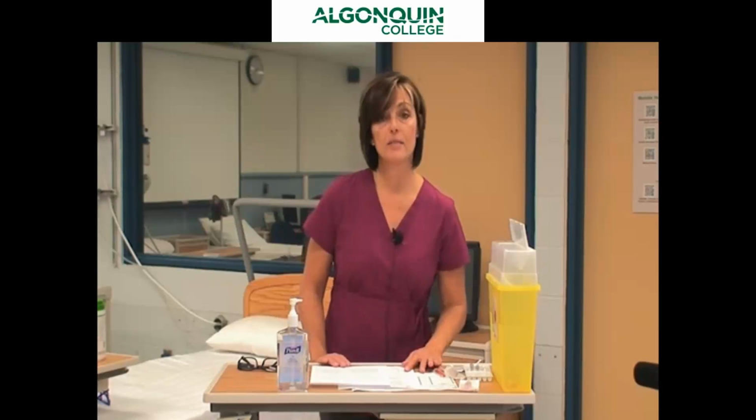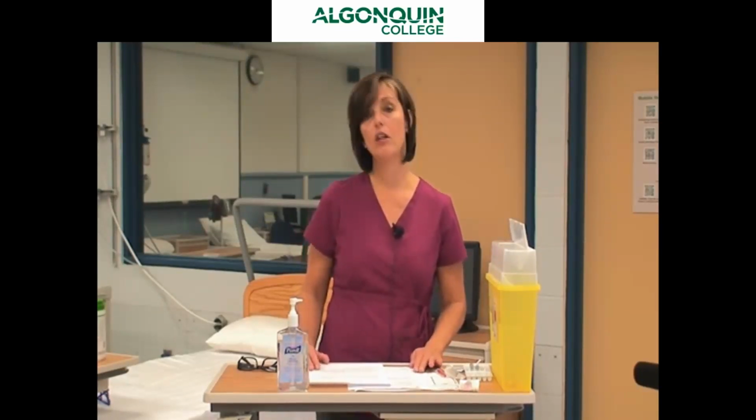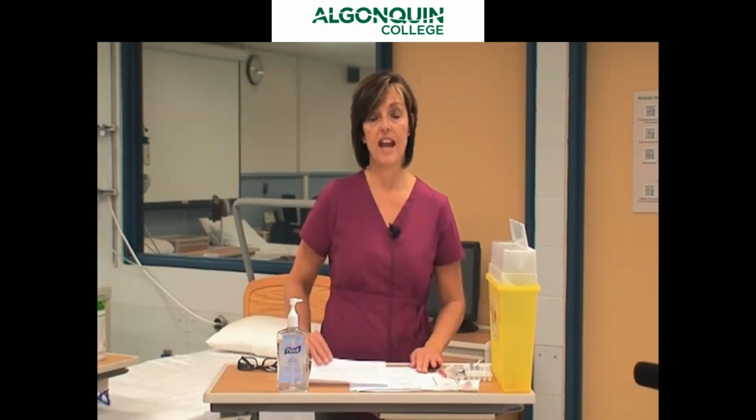So for Noelle Smith, we have a doctor's order for IM Gravol, 25 to 50 milligrams, as needed every 4 to 6 hours. Noelle Smith is feeling a bit nauseated, so we're going to give her 25 milligrams to start.